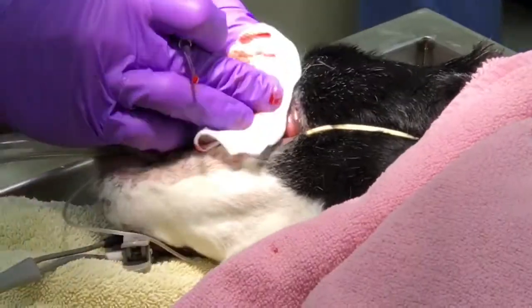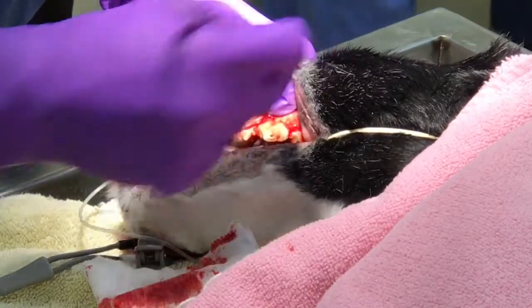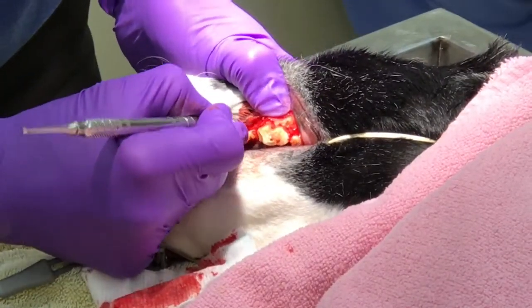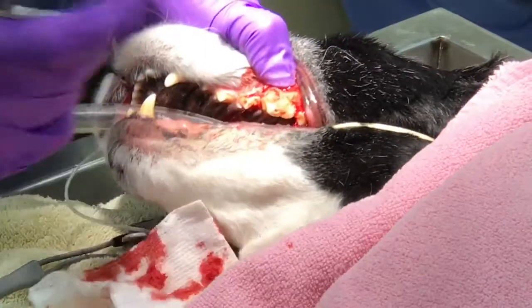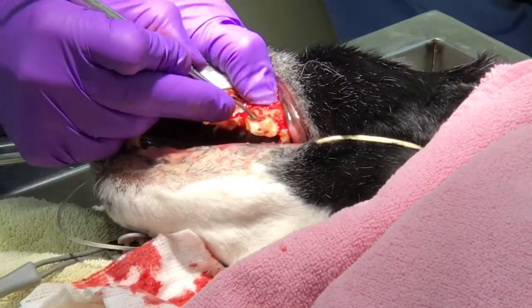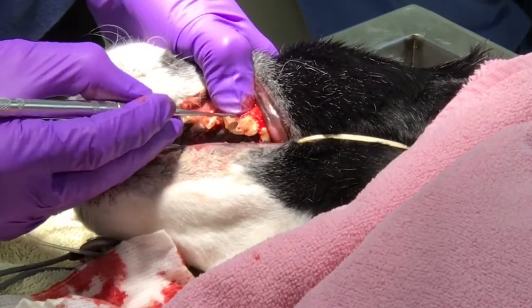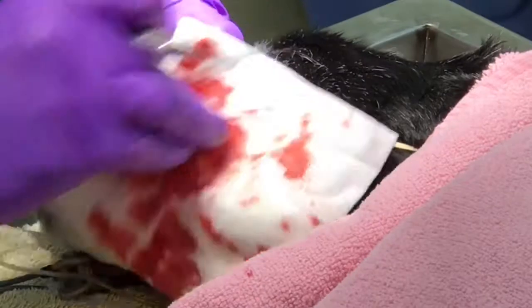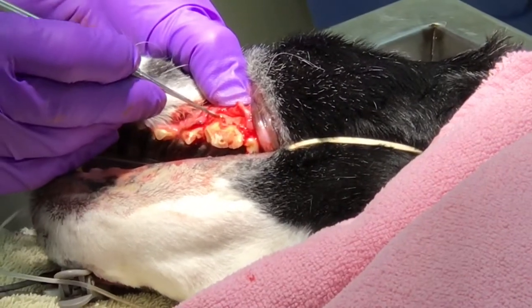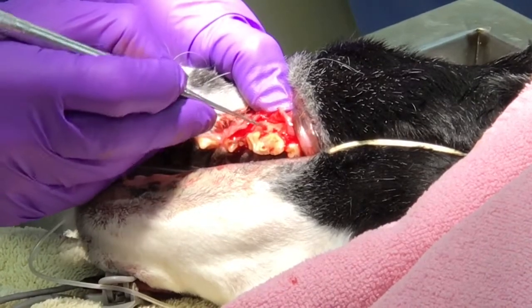Alright, so now we have better access to the bone that incorporates and houses the root. You can already see how much damage. This bone has eroded all the way back. It should be up to about even with my thumb, so you've already got significant bone loss exposing this root right here, as well as the fracture extends all the way down into the root.